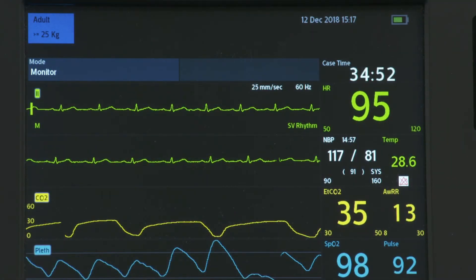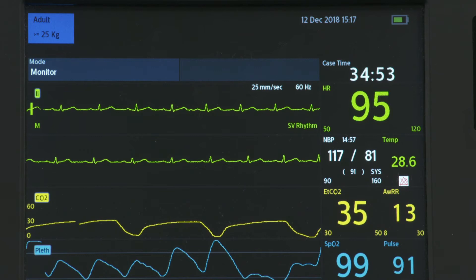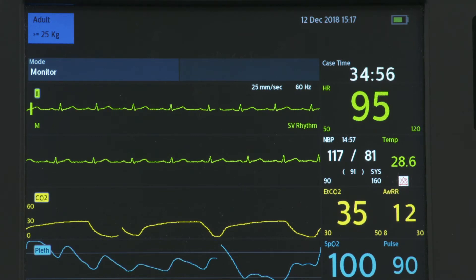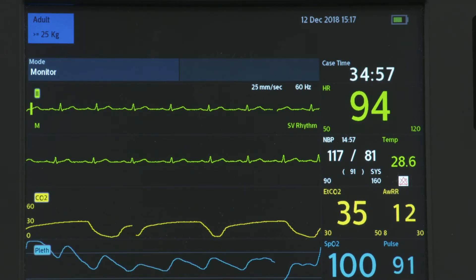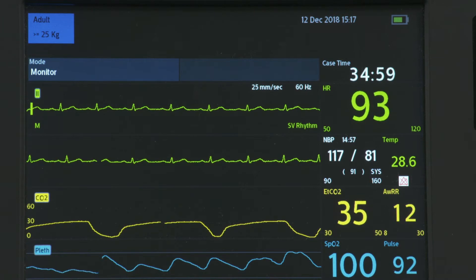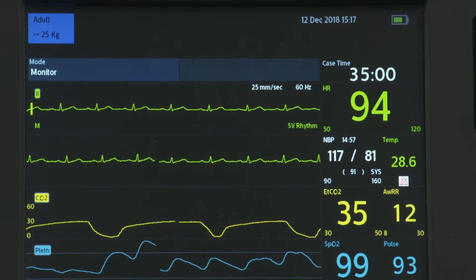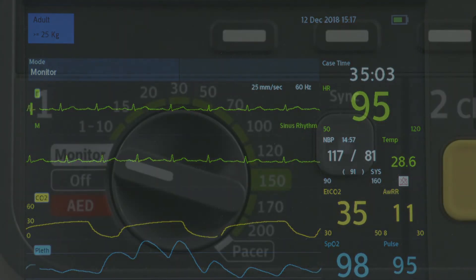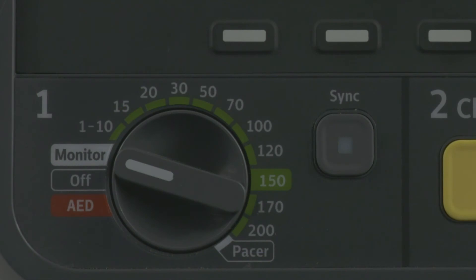The HeartStart Intrepid can store up to 8 hours of VitalSigns trending data for review and printing. To view this stored trending data, the HeartStart Intrepid must be in Monitor mode.